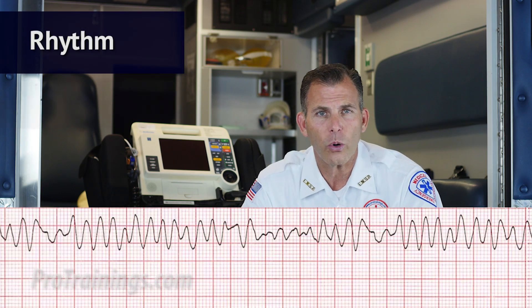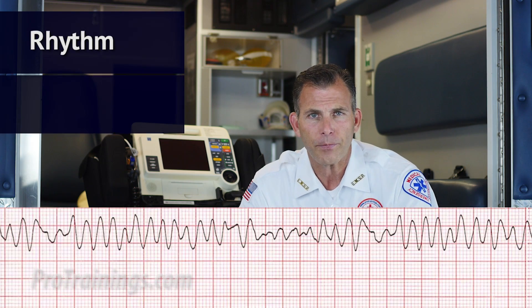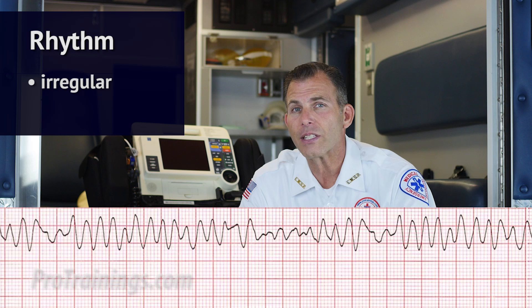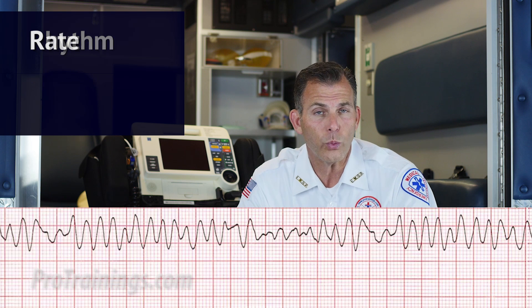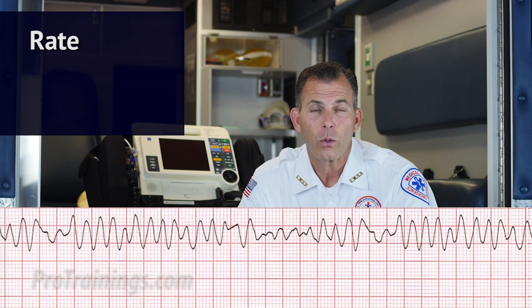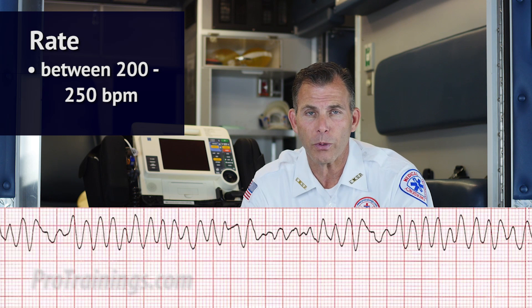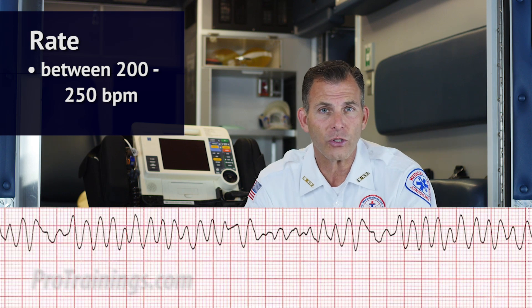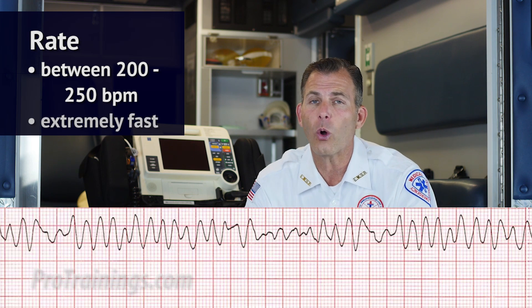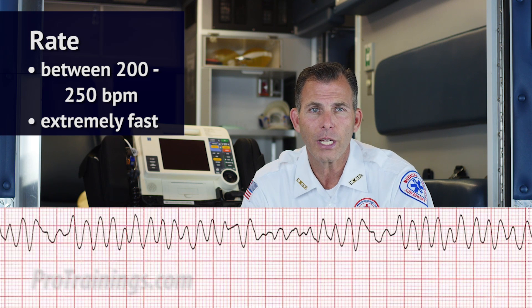When we look at the EKG, we still want to ask ourselves some questions. Is the rhythm regular or irregular? In this case, it's irregular. If we ask ourselves what's the rate, we're somewhere between 200 and 250 beats per minute. So is that rate normal, fast, or slow? Of course, the rate is extremely fast.